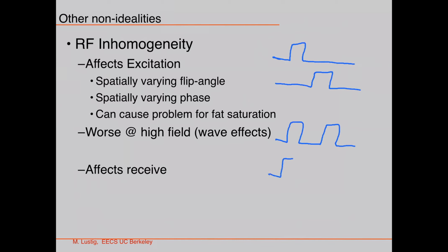And then this one and this one, right? It's exactly the same amount of time, right? So the thing is, when you collect this data, you don't collect any information from those spins. So if you think of just collecting data, here I'm spending half the time collecting data for this slice and half the time collecting this.